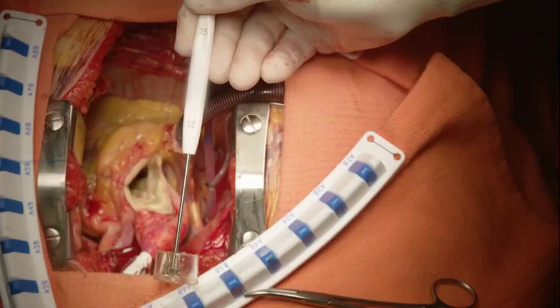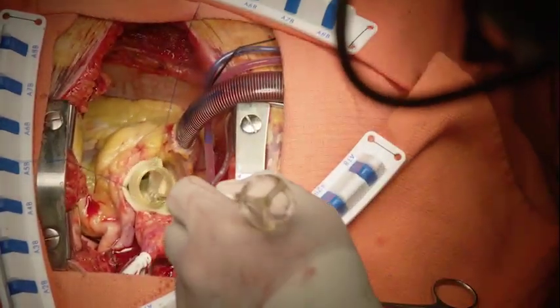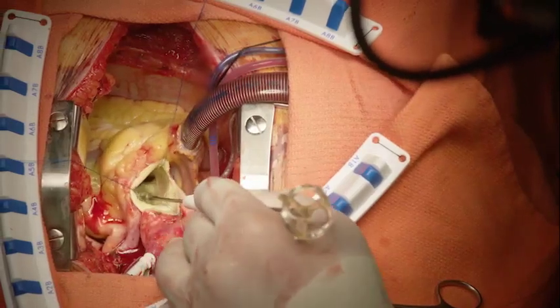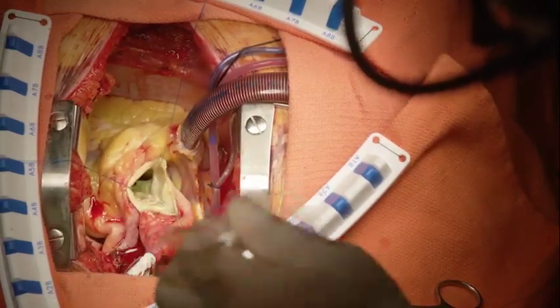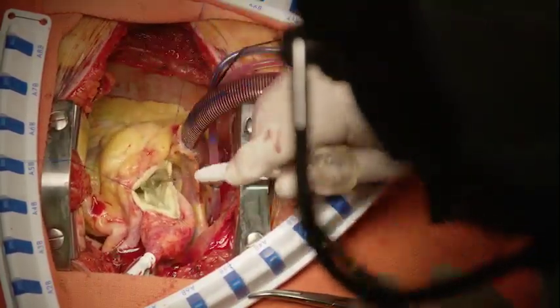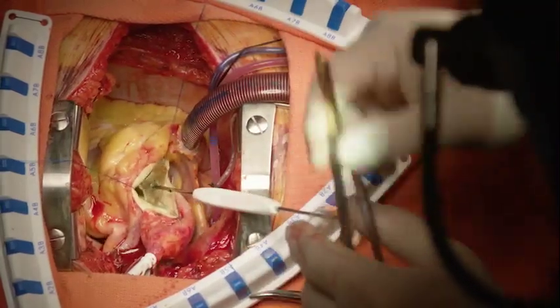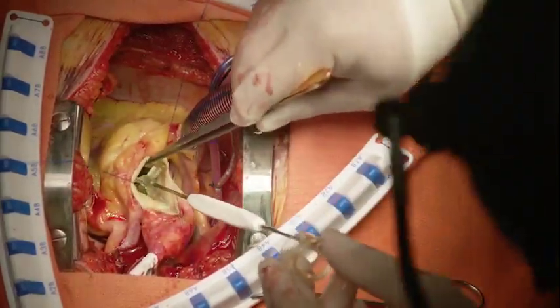This is a 25-millimeter Avalus sizer. The barrel end goes through the aortic annulus with a moderate degree of resistance. However, the replica sizer barely fits into the aortic root, and when it does, there is significant overlap of sinus tissue underneath the replica sizer, indicating that this would be too large a prosthesis for this aortic annulus. The replica end should always be used when selecting the valve size.